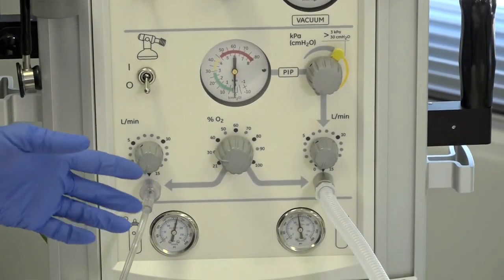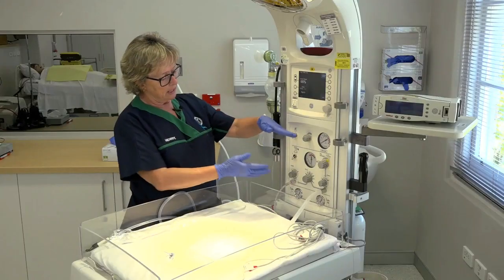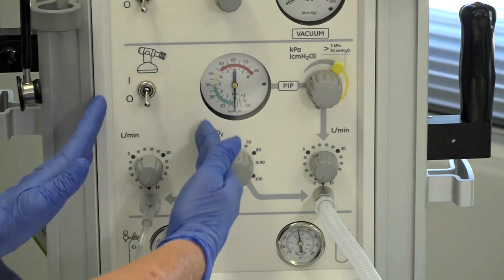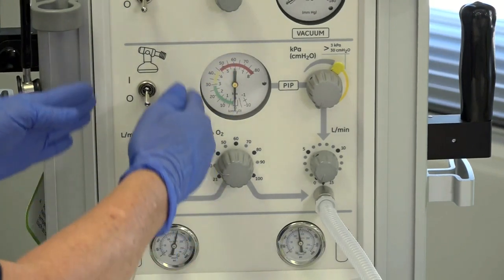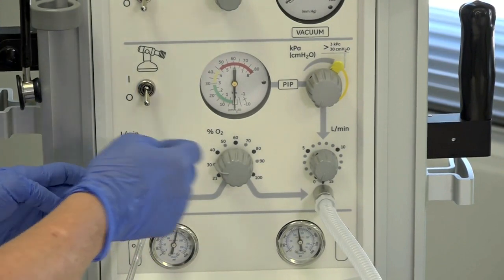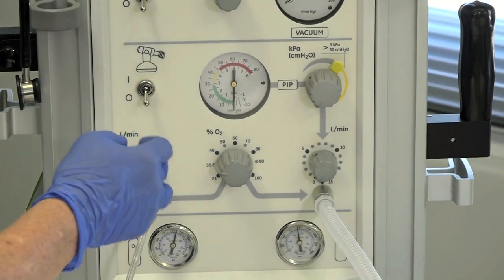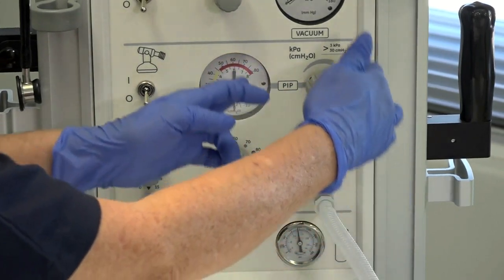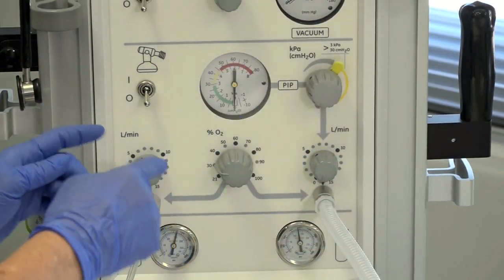Now we're below the grey line — we're on the ventilation component. This side here is related to the gas supply to our bag and mask. But first up we're going to check the settings for the T-piece itself.